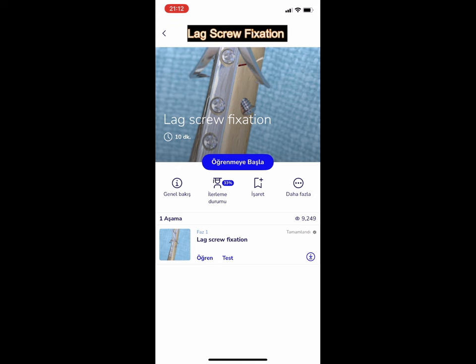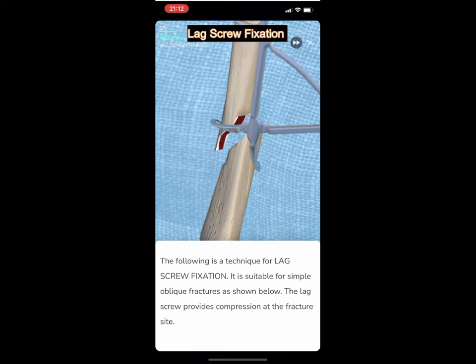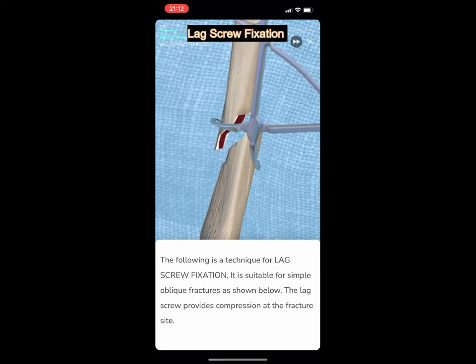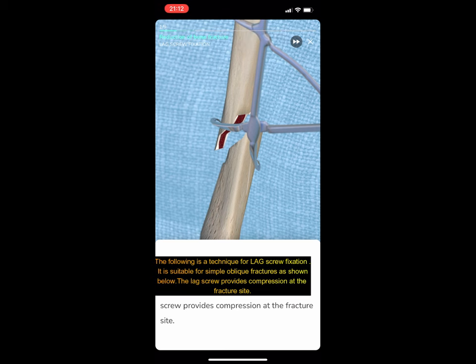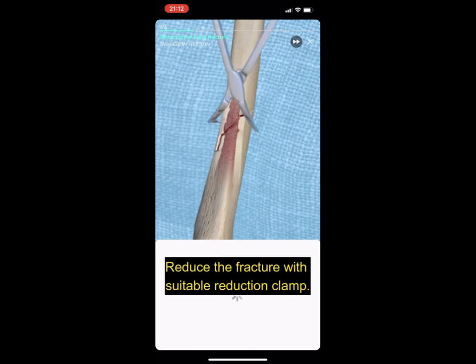Lag screw fixation. The following is a technique for lag screw fixation. It is suitable for simple oblique fractures as shown. The lag screw provides compression at the fracture site.